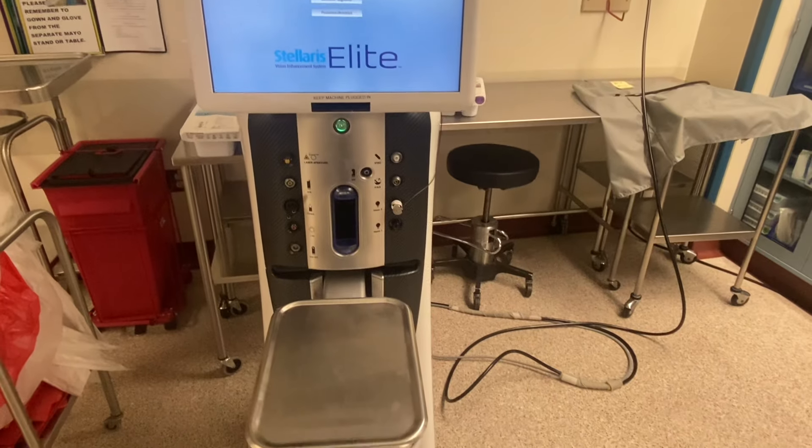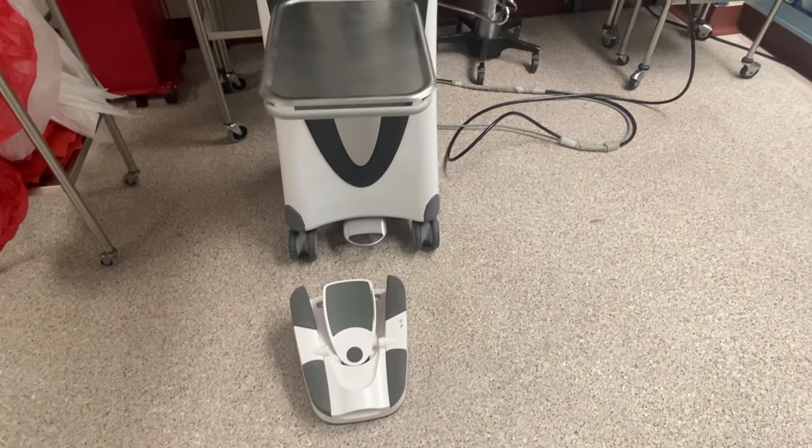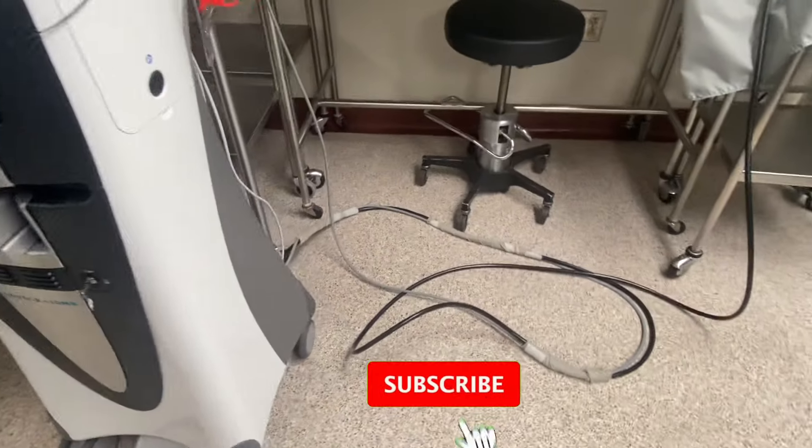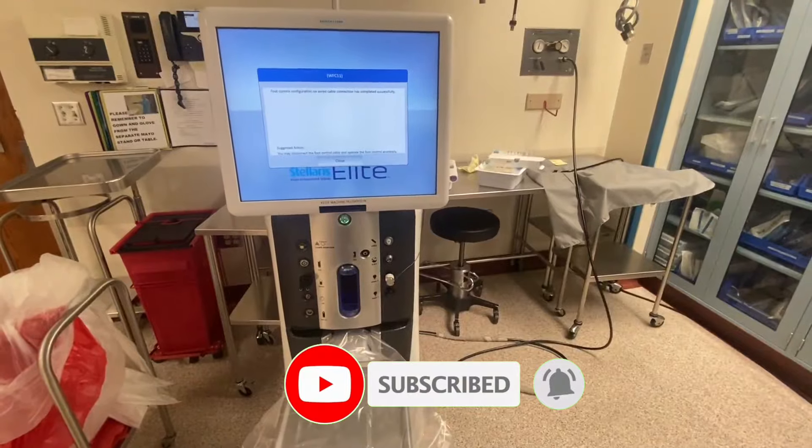Stellaris Elite has a venturi pump, which means that the vacuum in the machine is created by the flow of nitrogen or compressed air. So the first step in making the system work is to connect it to the nitrogen source, otherwise there will be no vacuum.